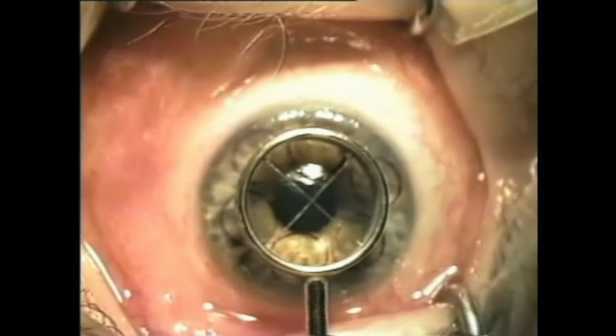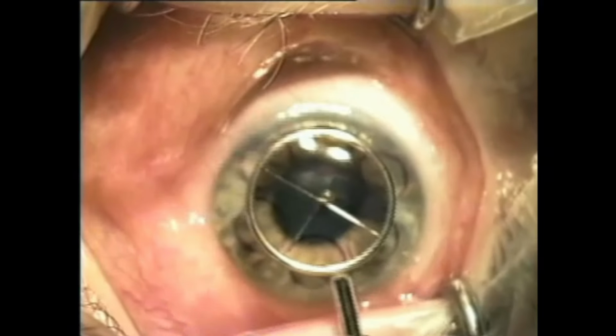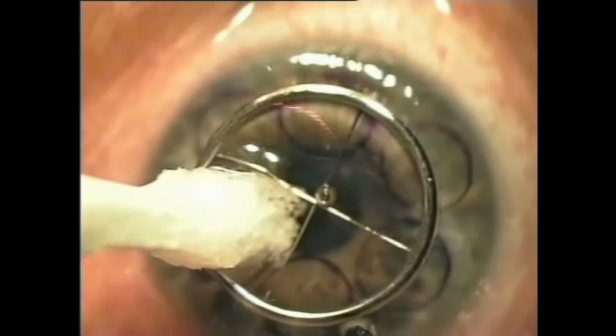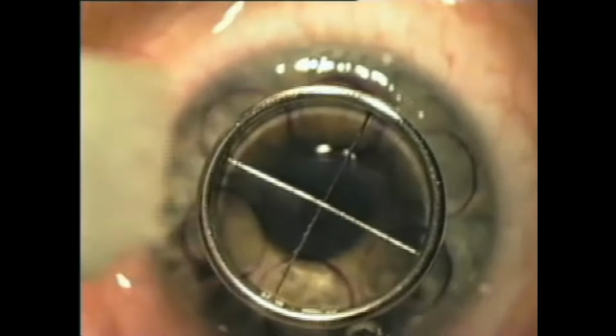Alcohol is then applied using a 7mm marker on the corneal surface. The marker has sharp edges similar to a trephine, and the pressure on the epithelium results in a shallow incision through epithelium, stopping at Bowman's layer. As alcohol covers the epithelium, the adhesion between the epithelium and Bowman's layer is weakened, allowing mechanical elevation of the epithelial sheet. The flap gutter is then dried.